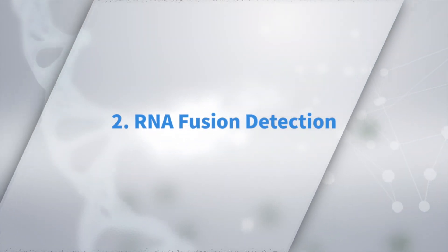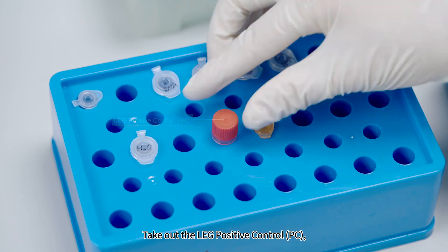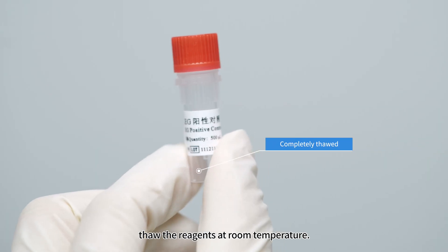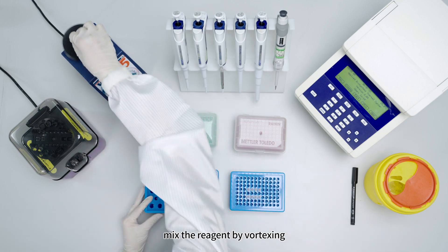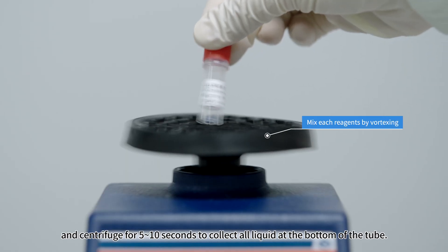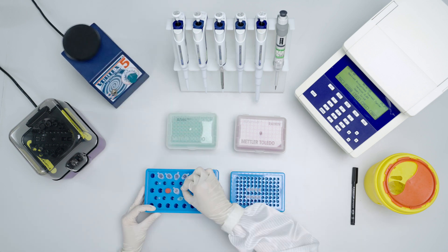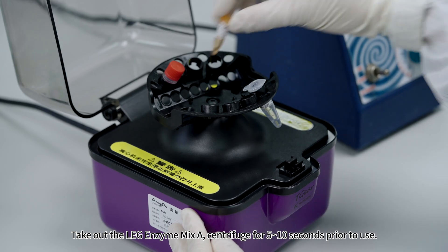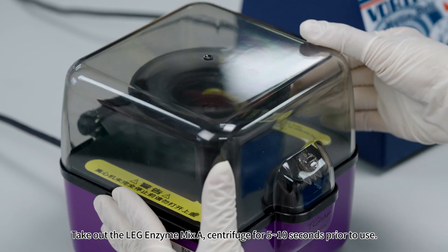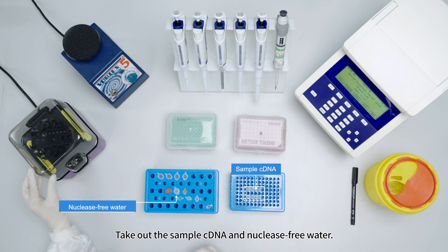For RNA Fusion Detection, take out the LEG Positive Control. Thaw the reagent at room temperature. When completely thawed, vortex and centrifuge for 5 to 10 seconds to collect all liquid at the bottom of the tube. Take out LEG Enzyme Mix A and centrifuge for 5 to 10 seconds prior to use. Take out the sample cDNA and nuclease-free water.